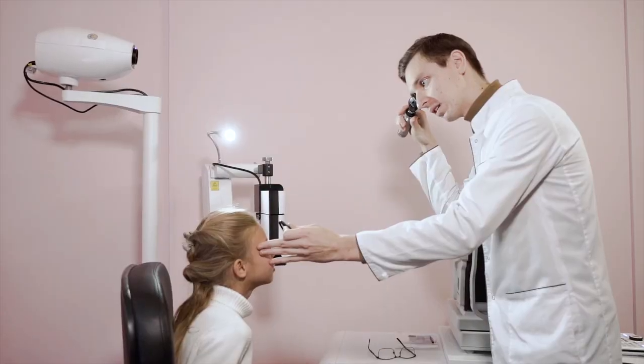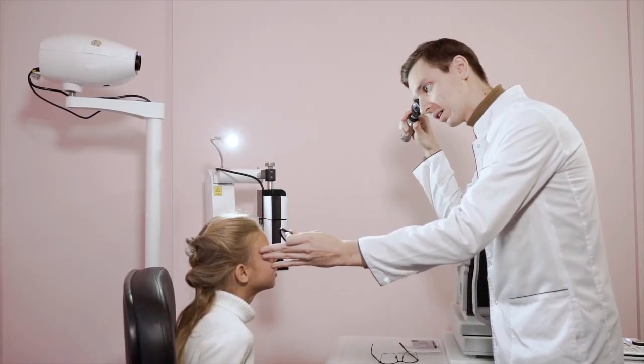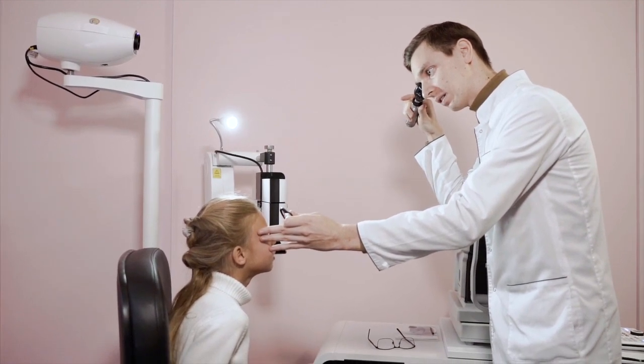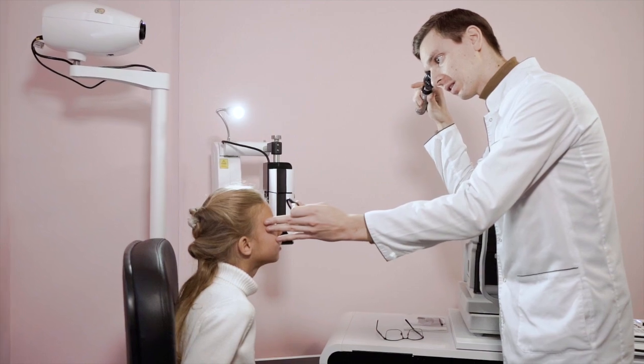Spectacle refraction and prescription. In order to get accurate power of the contact lens and eventually provide comfortable vision, your spectacle prescription should be up to date and precise. The spectacle prescription decides the contact lens prescription. A detailed subjective refraction should be performed to find out the exact power of the eye.